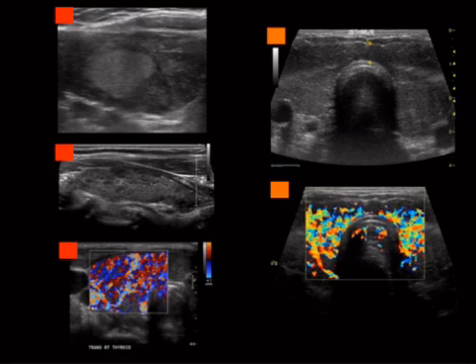So putting calipers on the isthmus is gamesmanship for telling that the thyroid is enlarged. That's thyromegaly, or this patient has a goiter. Notice that both the orange and the red have a lot of flow in them. So that's sort of equal. And then on the red, we've got a hyperechoic nodule, and then we've also got a heterogeneous parenchyma there on the second lesion.